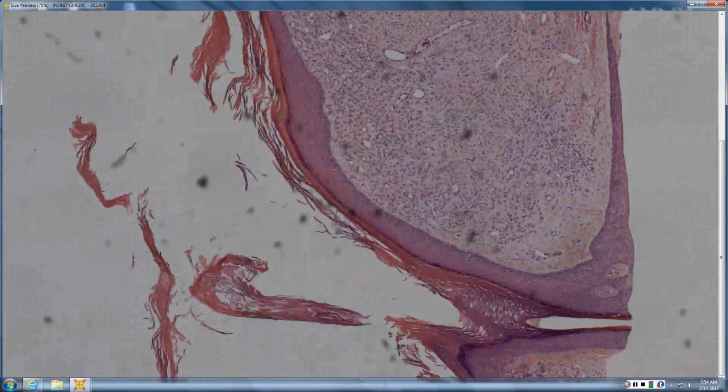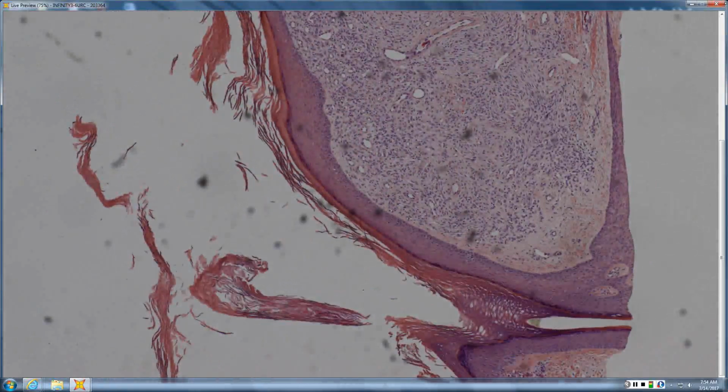So, take the easy way. If it's a good-sized fibrous tumor, look at your epidermis first. If it's anywhere near the epidermis, it will react appropriately: effaced from most tumors, acanthotic from a DF. So if it's a pretty decent-sized fibrous tumor close to the epidermis and the epidermis is thick rather than thin, your first question is, can I fit this into any kind of DF category?